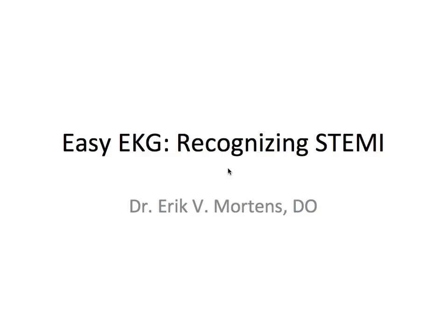So today's topic, and it's a topic that I've been asked a lot of questions about recently through your messages, is how you recognize an ST elevation myocardial infarction. That's what STEMI stands for. We're going to go over some things to look out for, and do's and don'ts, just the basics of, if you're working late in an ER in the middle of nowhere and you're trying to figure out, is my patient having a heart attack or not? So let's get to it here.